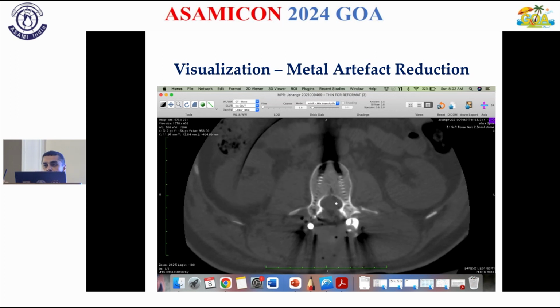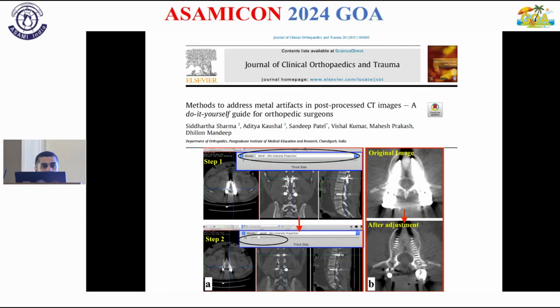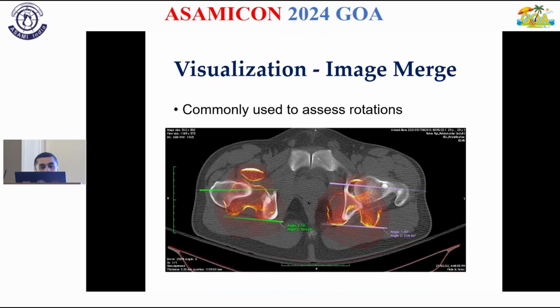Maybe you want to see if your tibial plafond screw is intra-articular, right? And we have published this. You are free to read this article. There are some other tips and tricks there as well.